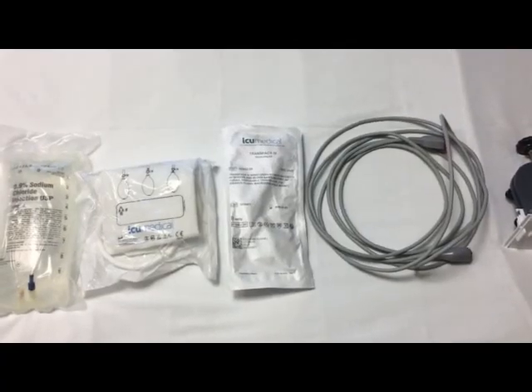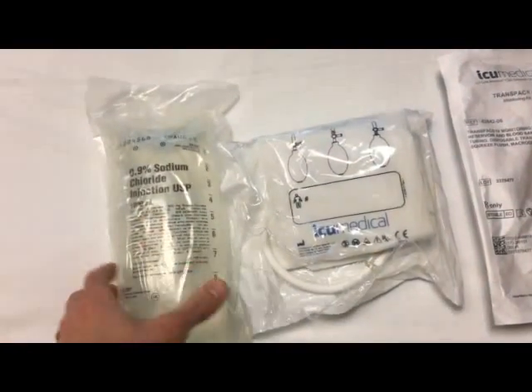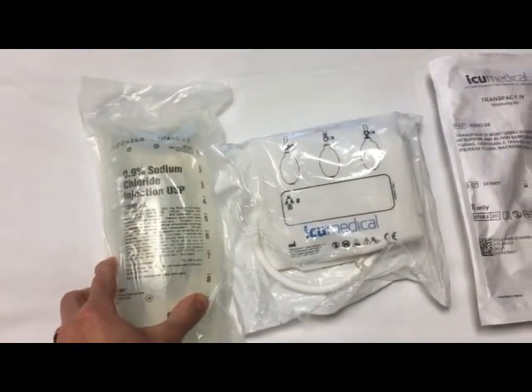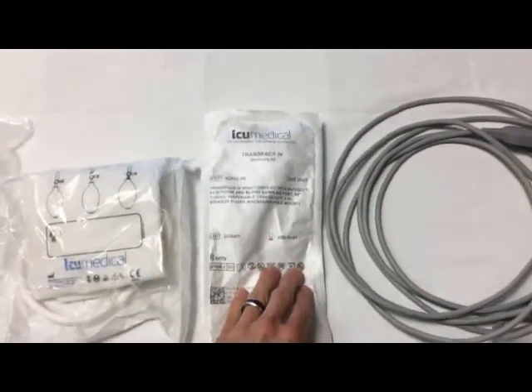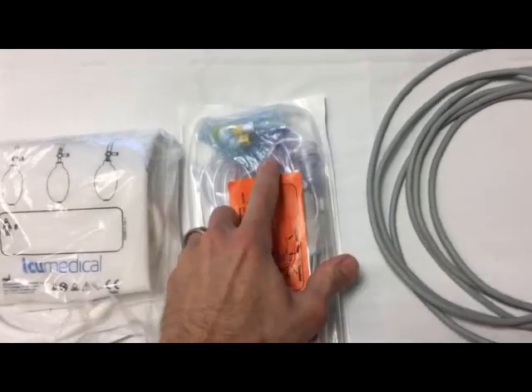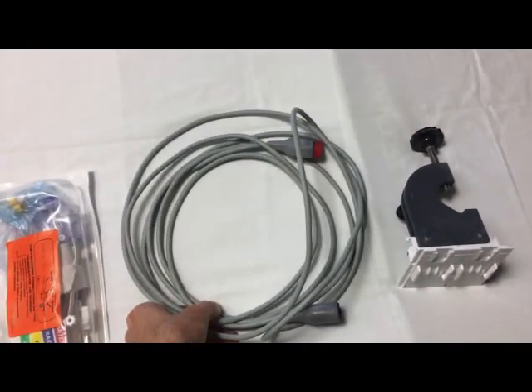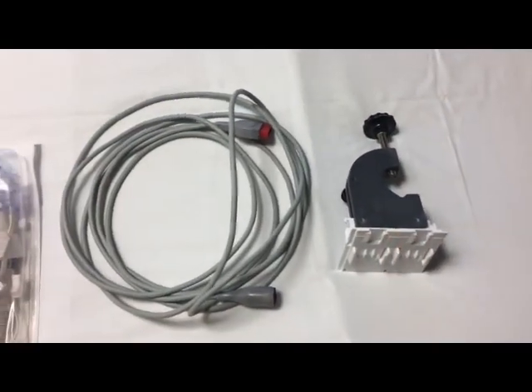While the provider is placing the line, use this time to set up your transducer. This includes a bag of saline, unless otherwise ordered, a pressure bag, a Transpac IV monitoring kit with safe set reservoir — which can also be viewed through the packaging — a transducer cable which is red, a transducer holder, and an IV pole.